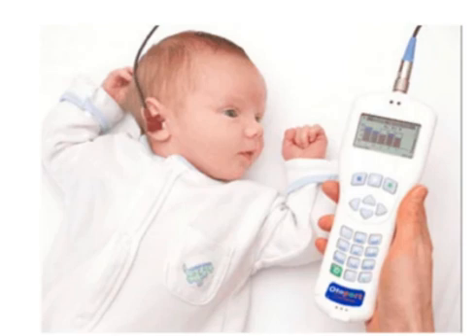Introduction. Otoacoustic emissions, OAE, are sounds generated from the cochlea, transmitted across the middle ear to the external ear canal, where they can be recorded. The production of an OAE is a marker for inner ear health and a simple way to screen for hearing loss. There are two types of OAE: spontaneous OAE, SOAE, which occur continuously without external stimuli, and evoked OAE, EOAE, which requires an acoustic stimulus prior to its measurement.